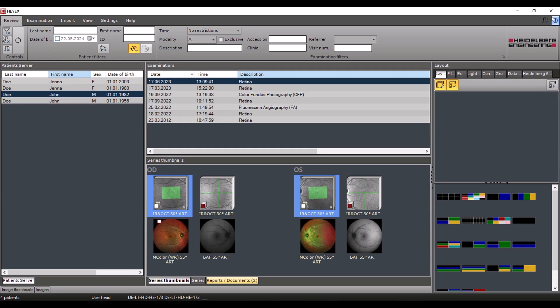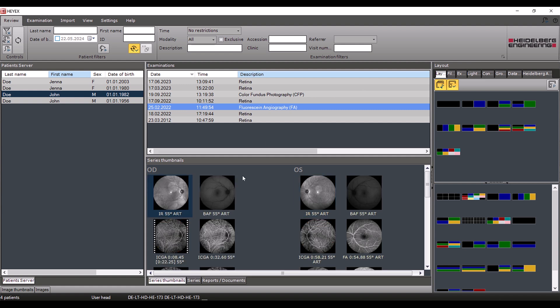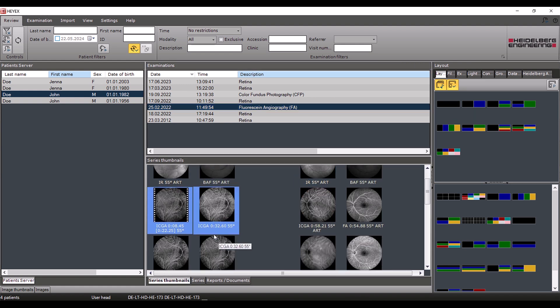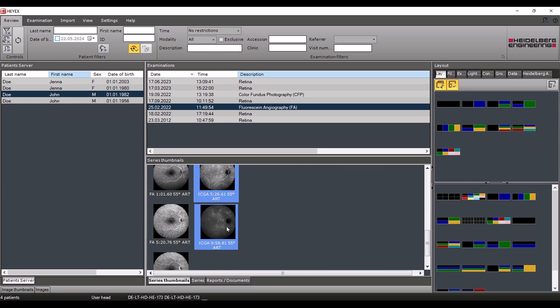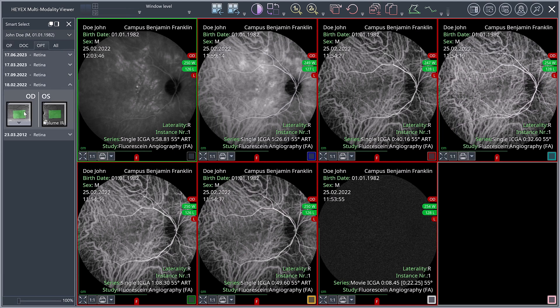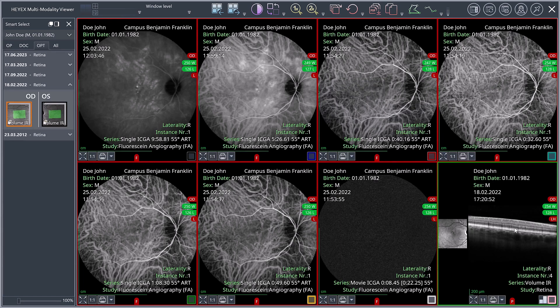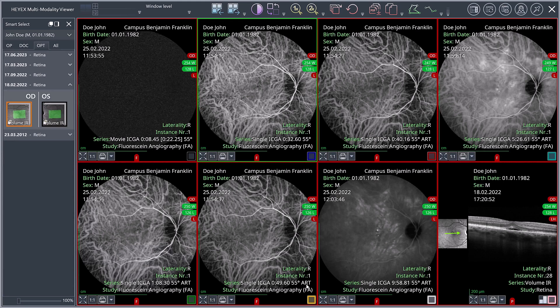The Multi-Modality Viewer is also ideal for displaying fluorescein or, as in this example, ICG angiographies. If you drag and drop seven images into the layout with eight viewports, one viewport remains free, to which you can drag and drop a chronologically appropriate OCT image. All the previously mentioned options for swapping images within the viewports and exchanging images from the Smart Select window are also available here.